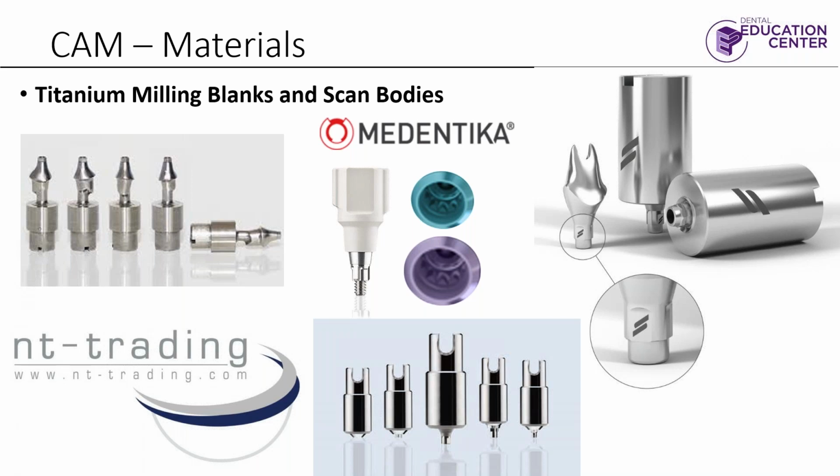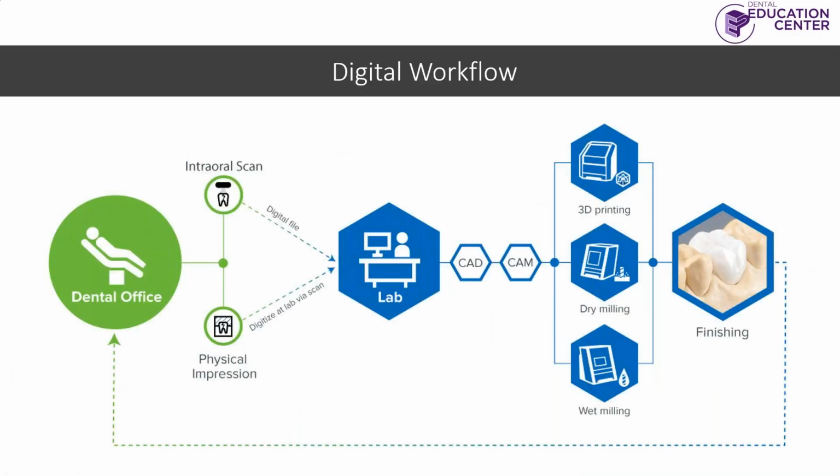And so they basically now produce knockoff blanks for the entire industry, which is always a fun analogy if you want to think about it. But also if you keep talking about warranties and that kind of thing, read your warranty, because if you really have a good lab, the Straumann will give you the part back, and that's about it. A good lab will actually remanufacture everything for you in case there's a problem. But these are all Grade 5 titanium, really good stuff. Again, we're still back in finishing and processing.